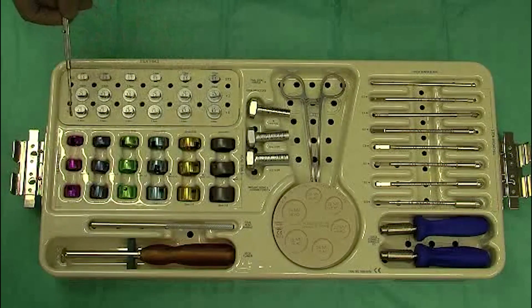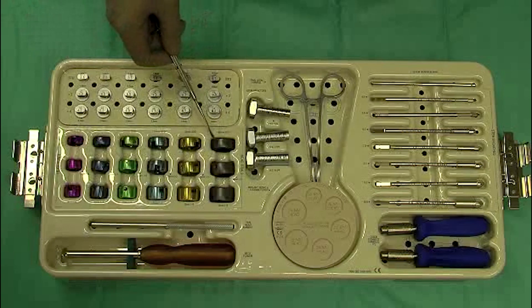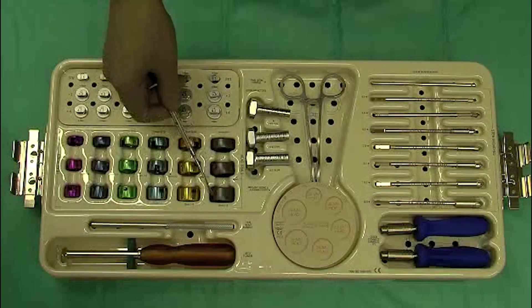In addition, we have radial head implants varying in size from 18 up to 28 millimeters, again coming in standard, plus 2, and plus 4 lengths.